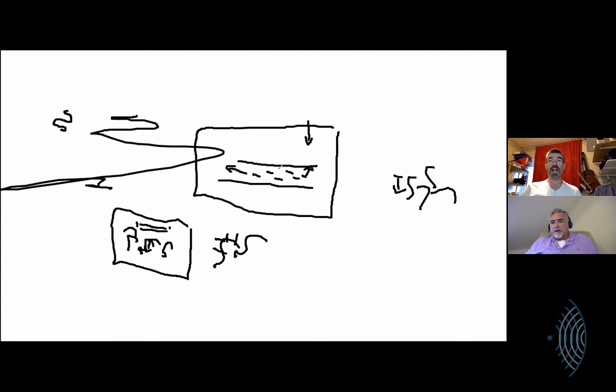So when you've got your color on, what's happening is you create a grayscale picture in maybe 1/40th of a second. Then this stuff switches off, and you create a different sort of pulse, which looks more like a sine wave with about 10 cycles in it. And that's a Doppler pulse. I had no idea, John. So there are 2 completely different pictures being superimposed on each other, made up with 2 completely different sound waves.